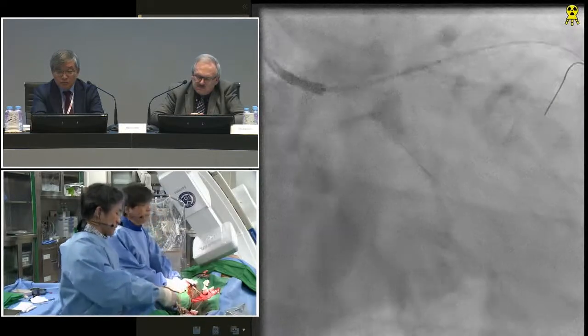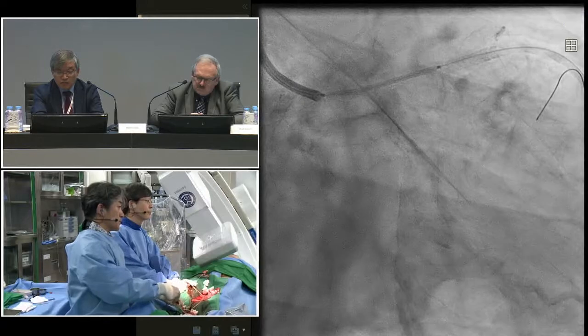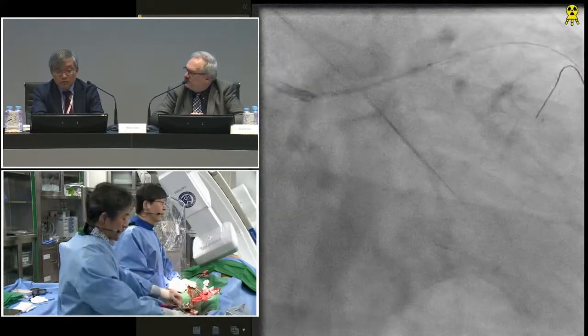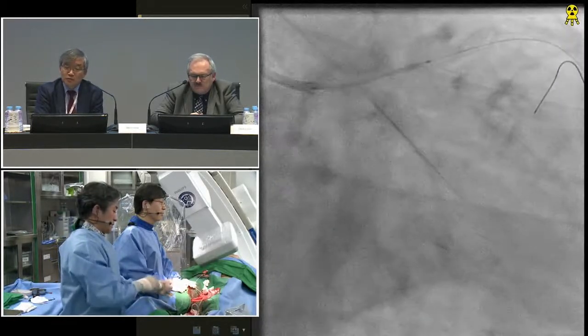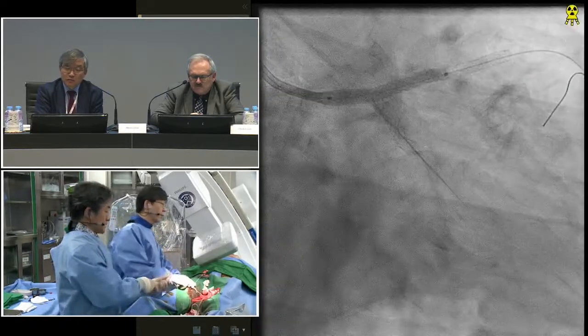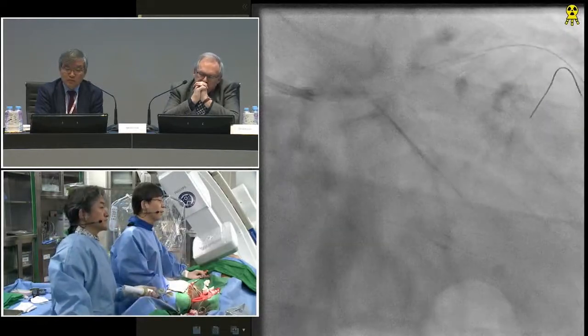Let's take a shot. Yeah. Okay, I'm ready. Pretty nice, eh? Okay. In terms of length. Hold on. 11, 12, 14, 16. This is a 16. 3.5.